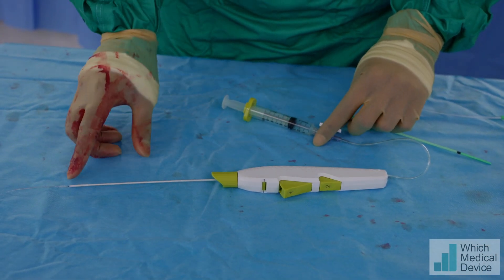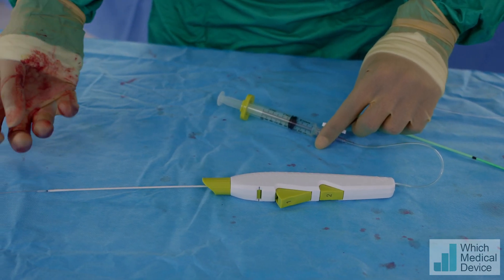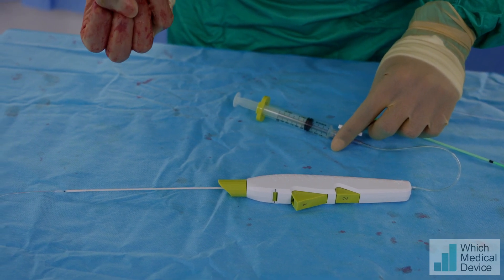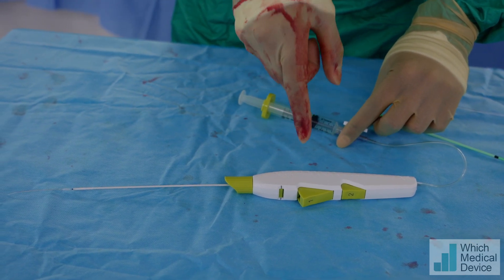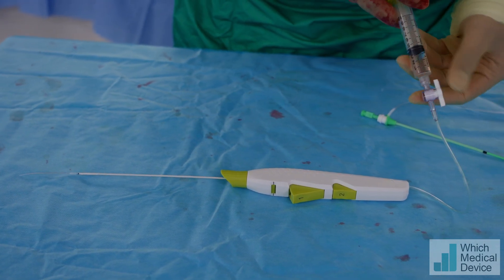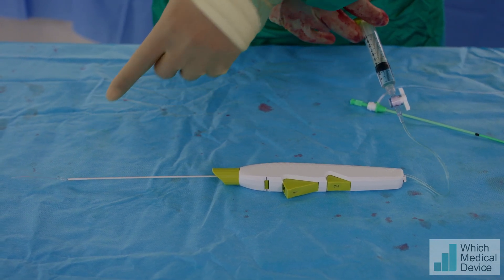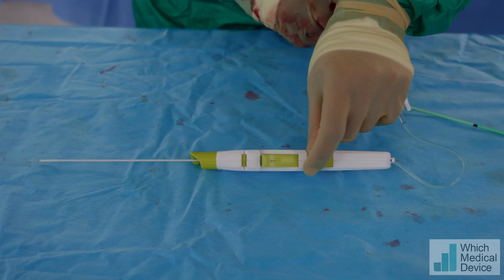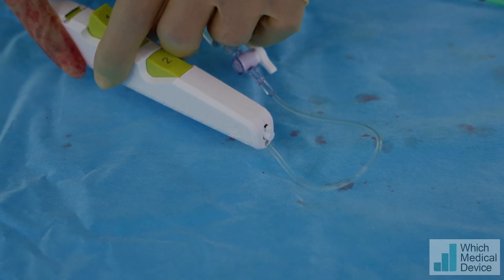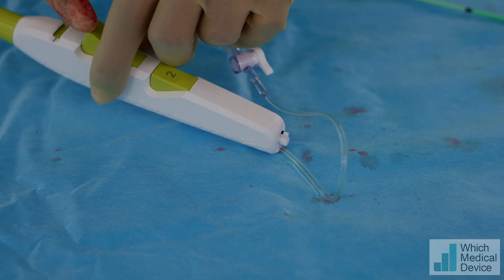The way the device works is there's a balloon at the end of the closure device which inflates. Once it's inflated we pull it back, and that forms the tension on the inside of the vessel. Then we deploy the polyethylene glycol from the main body of the device. So I'm going to show you how it works on the outside. I inflate it and you can see the balloon is working. At the same time, at the end of the device there is a white, black, white marker — that's what we'll see on the outside, since we obviously won't be able to see the balloon working on the inside.